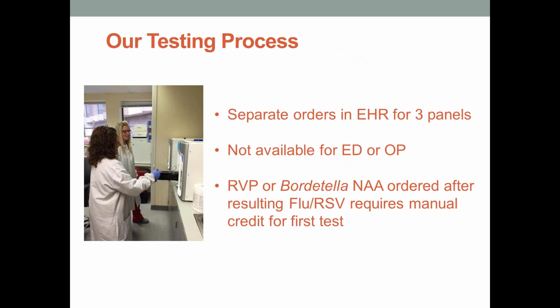Some limitations on our testing. We don't offer the testing for outpatients other than in our bone marrow transplant clinic. We don't offer the testing for the emergency department unless the patient is being admitted, except for Bordetella. We do allow Bordetella to be done in the outpatient setting because we thought that made a lot of sense for people who may be seeing the physician with concerns about pertussis.